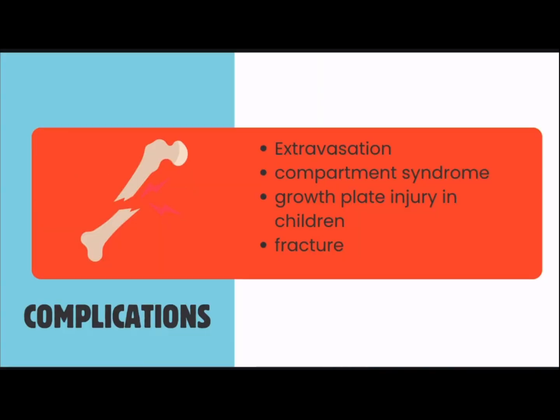Lastly, let's talk about some complications. So extravasation, we've talked about this repeatedly throughout. Extravasation is leaking of fluid into the surrounding tissue. We're going to see that. We might also see compartment syndrome as a complication.